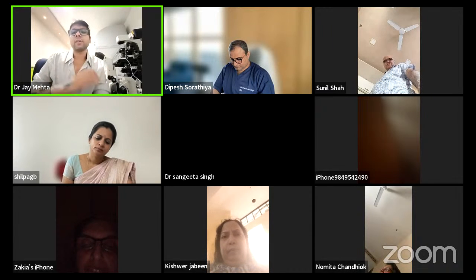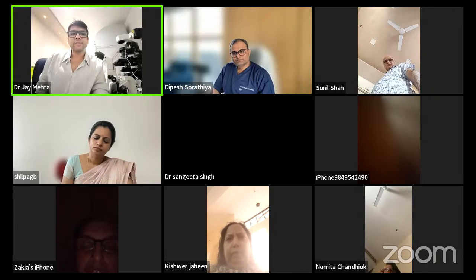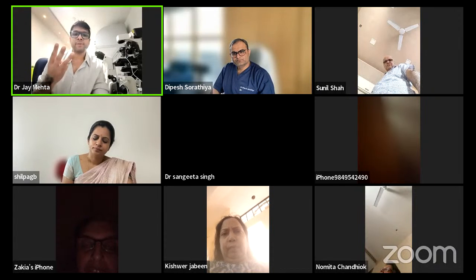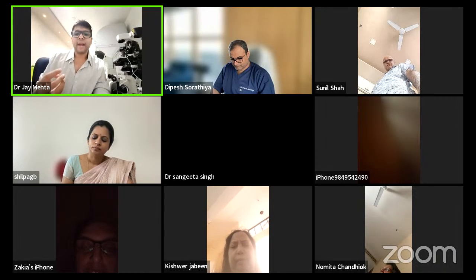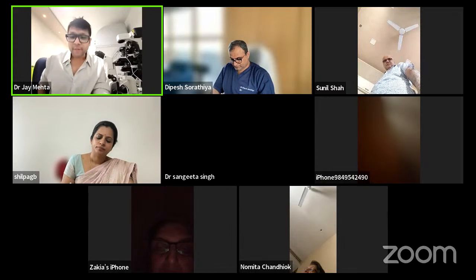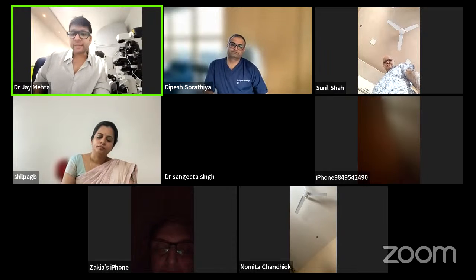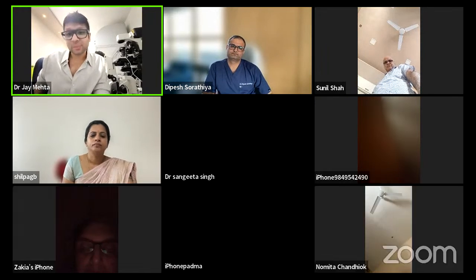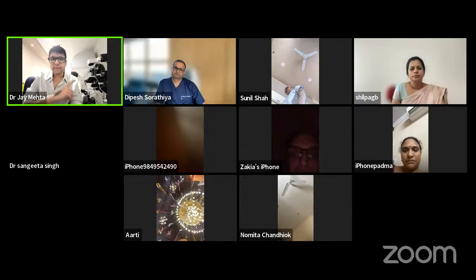Shall I transfer day 3 or wait till blastocyst? The clinical understanding is, if you have 3 excellent day 3 embryos, graded as equal blastomeres with less than 5% fragmentation, the possibility that one of these 3 will develop into a good blastocyst is very high, and it will give you excellent blastulation rates and implantation rates equivalent to a single expanded blastocyst embryo.